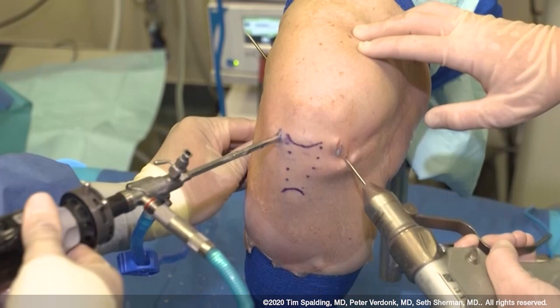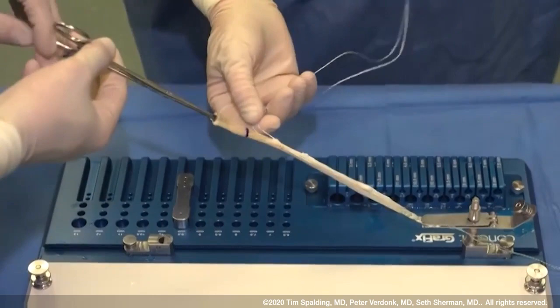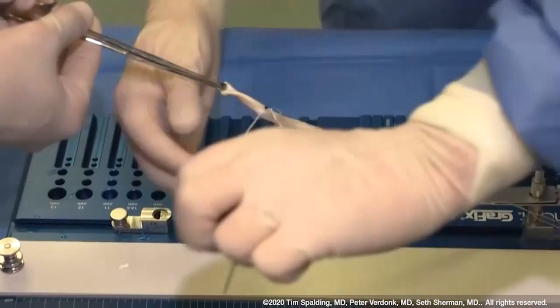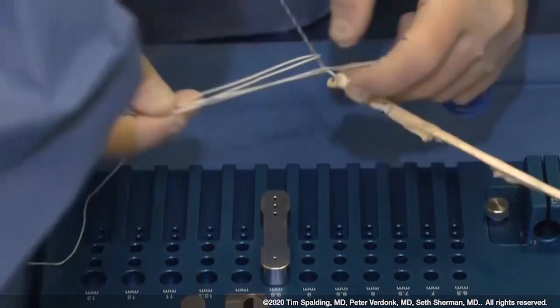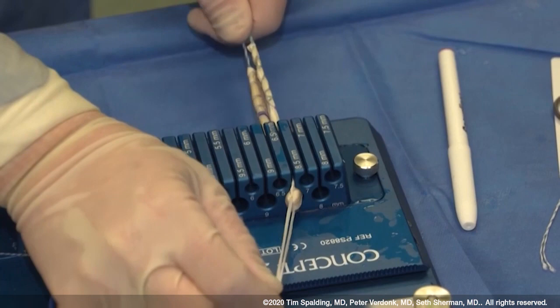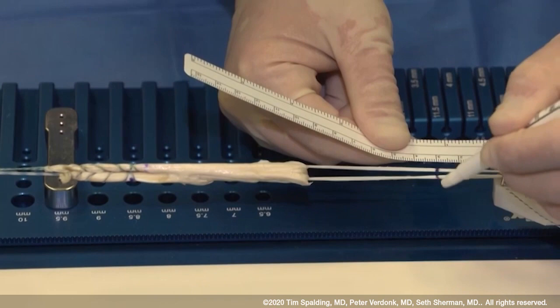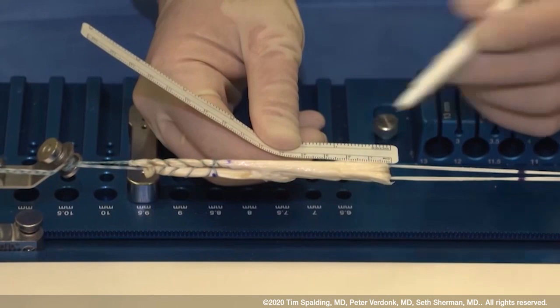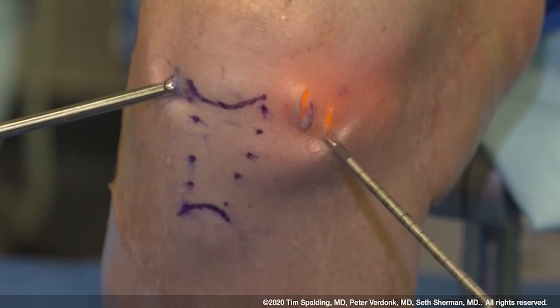The spade tip is passed out through the skin and a shuttle suture is passed. A large diameter graft is chosen for this example. The ends are marked at 30 millimeters and a number two Hi-Fi suture is used with a graft loop to prepare the free ends. The femoral infinity button is lengthened greater than 10 centimeters, and the looped aspect of the graft is placed in the center of the femoral infinity button, which is sized on the back table. The graft is pre-tensioned, and we measure the distance from the lateral cortex to the looped aspect, corresponding with femoral tunnel length. The graft is marked at 20 millimeters to indicate aperture insertion depth.